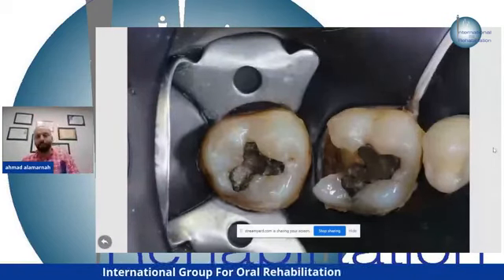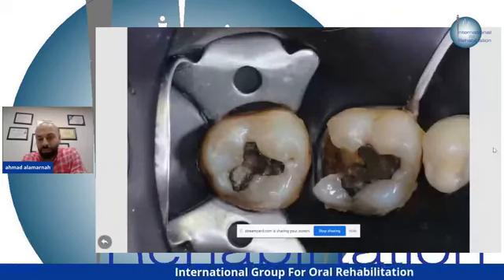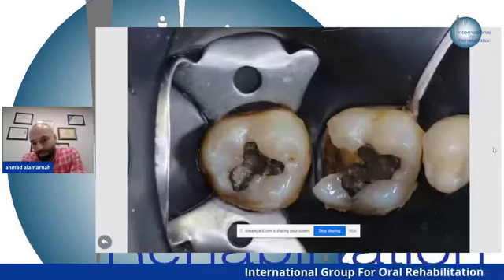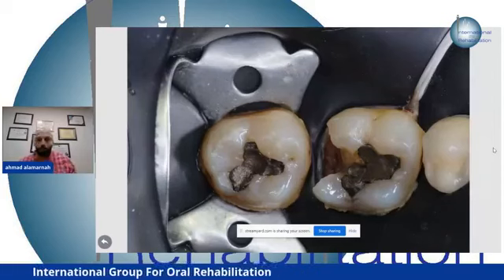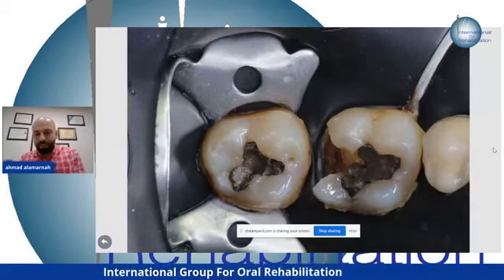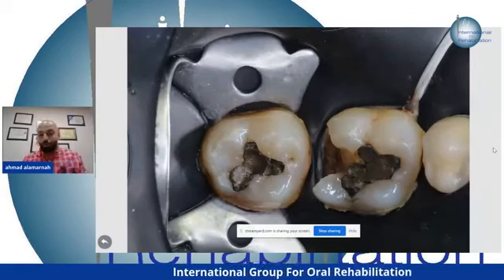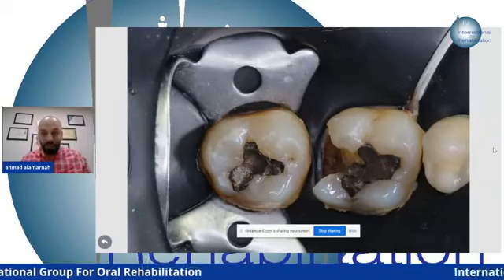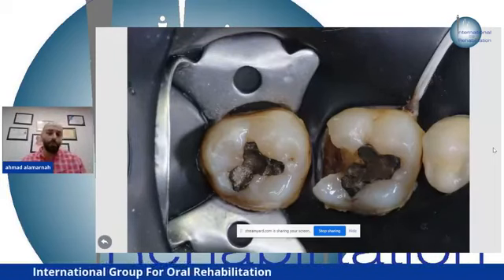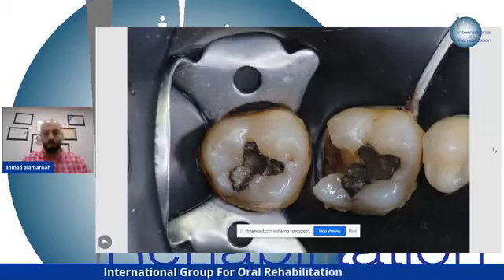Okay, let's continue. I isolate both the 6, the 7, and the 5. Always when you use the rubber dam, isolate a tooth before and a tooth after, because we need a wide field for working, and also you don't know if we have a defect in the 6, and it will turn into a class 2. So you have to establish or re-establish a contact. If you isolate only the 6, you will not be able to re-establish the contact between the 5 and the 7. So always isolate the tooth before and the tooth after.